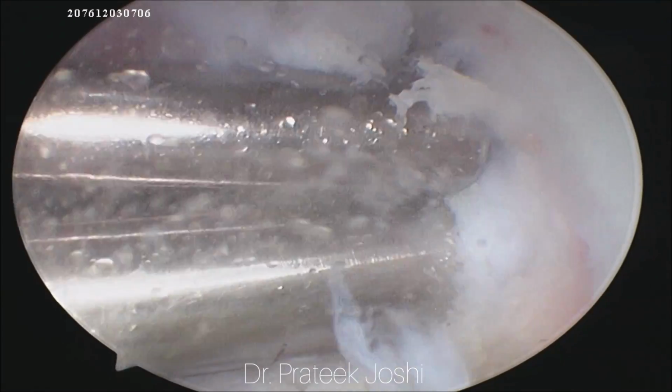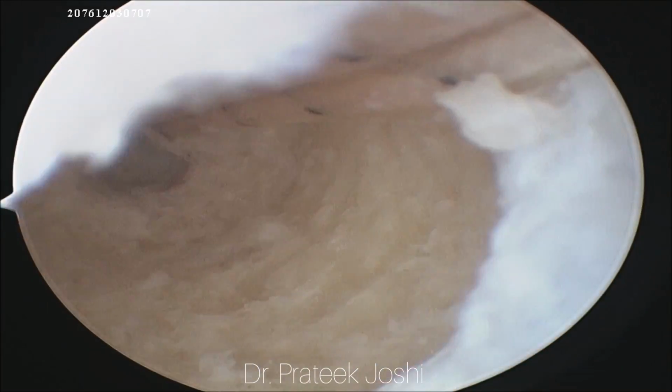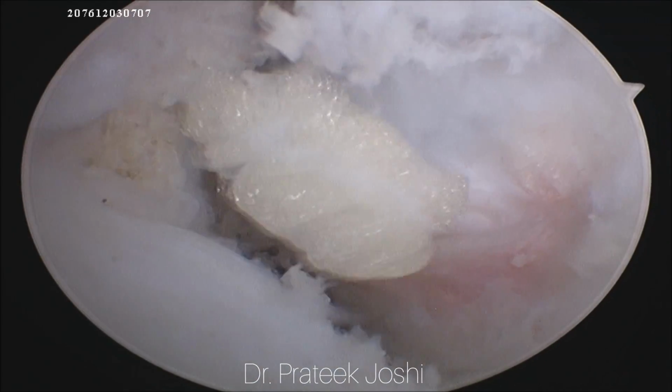So this completes the femoral tunnel preparation, and as you can see from the anteromedial portal, this is how our femoral tunnel looks like. You can see there is no blowout and it is perfectly in the anatomical footprint.